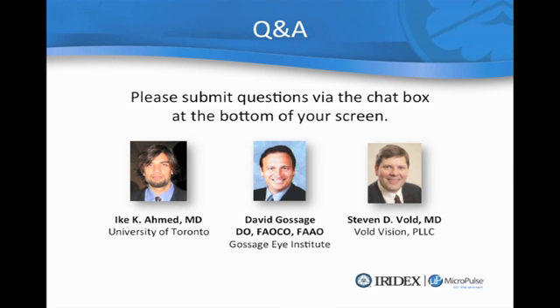Typically, what you have to remember is that when we're doing retinal work in the micropulse setting, we're using a 5% duty cycle. And I want to repeat that. It's a 5% duty cycle, not 15% that you would use for doing trabeculoplasty, but a 5% duty cycle. What I typically will do is put it in the continuous wave mode first. I'll start off with a 100 micron spot size and 100 milliwatts of power. I'll then titrate that up by 10 to 50 milliwatts of power until I see a little retinal whitening. Once I see the retinal whitening, I'll switch it over to the micropulse mode.